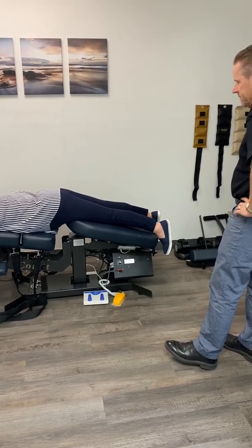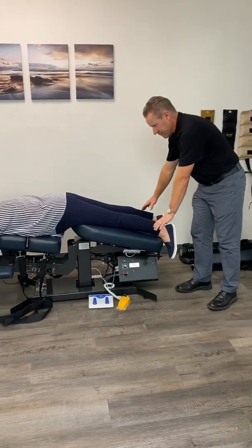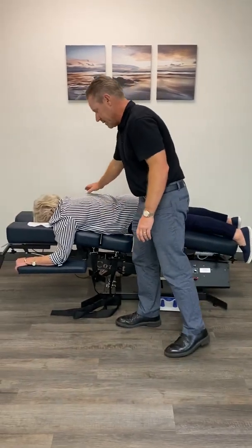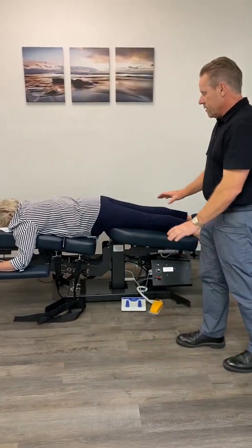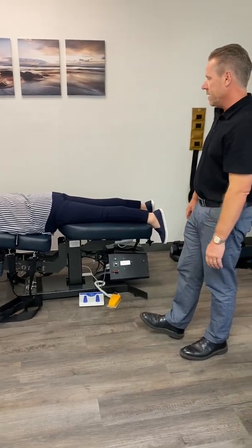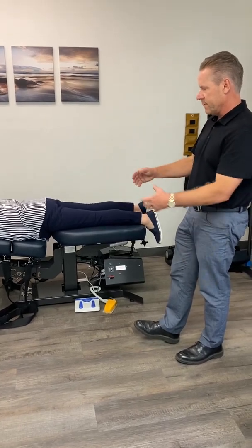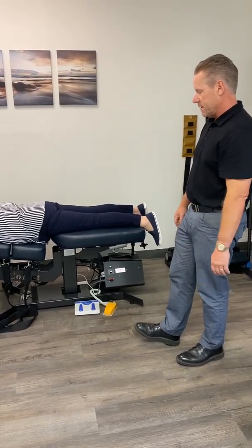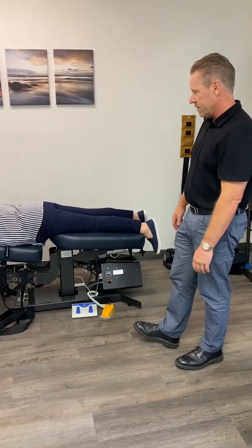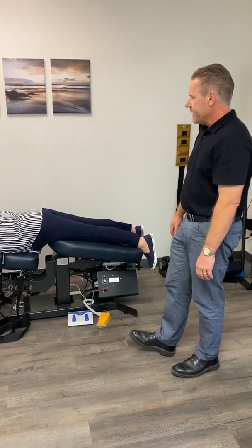I do, yes. And see, you'll notice that we didn't strap in the ankles, which we have the capability, and we didn't strap in the torso, which we also have the capability. You should never use those straps the first, maybe not even the second time, because really the person's body weight is enough to keep them on the table with them holding. The straps are a lot more aggressive, so introduce those once a person has already demonstrated tolerance to that.